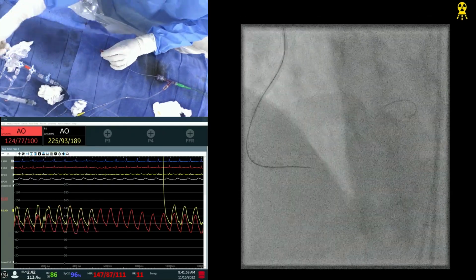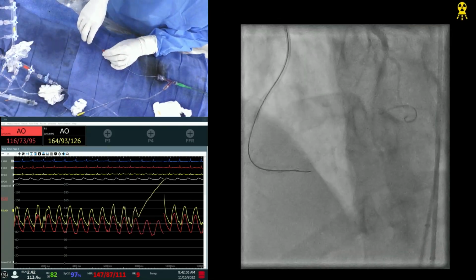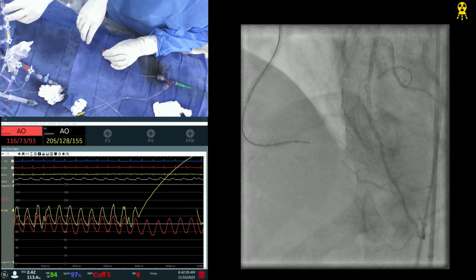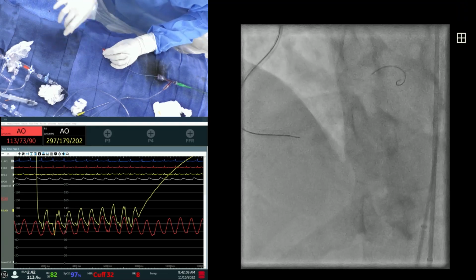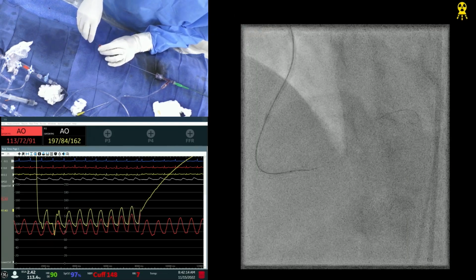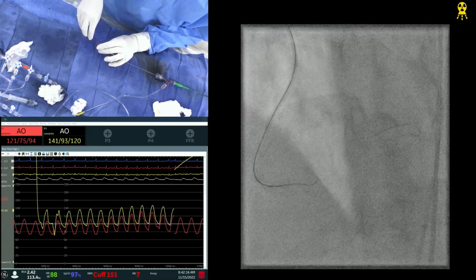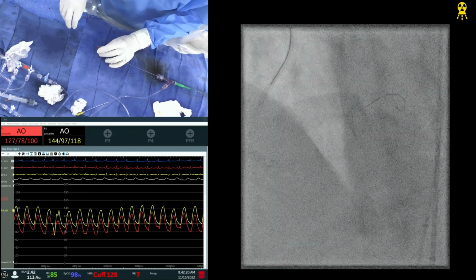Okay, can you take a cine? Okay. Injecting. Your ostium is blocked, therefore it means the wire is in the right position. Remember now, it is not coming back up to the ostium. Should have gone through. Okay, get me a.